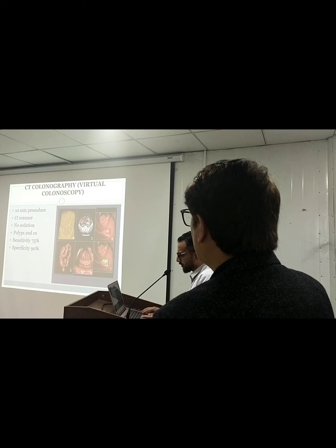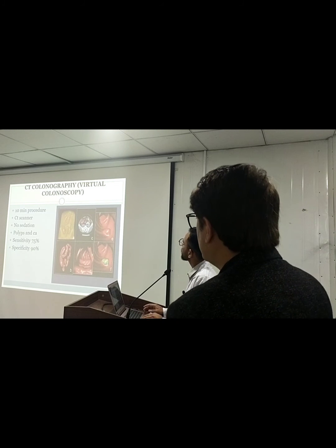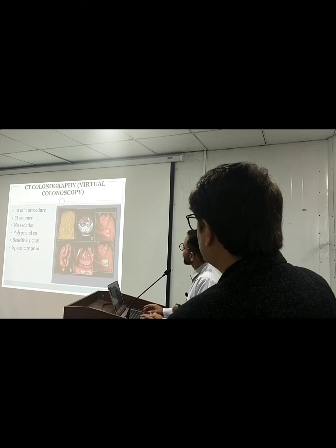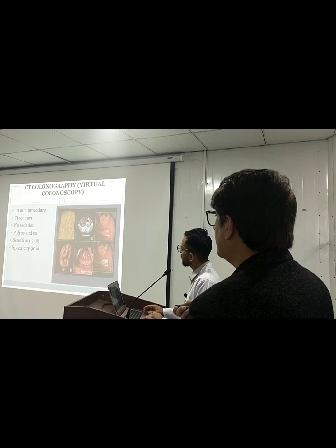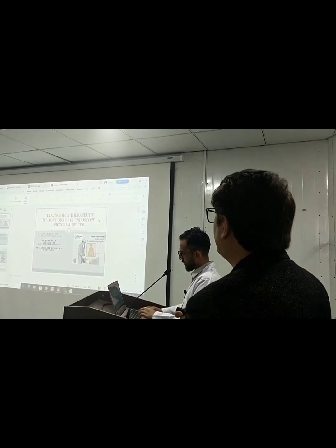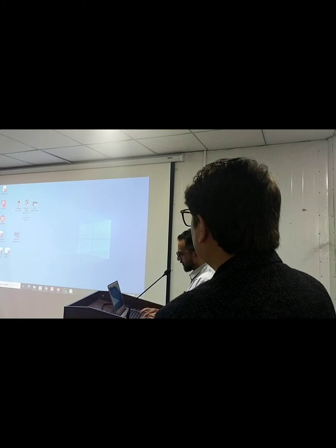CT colonography, virtual colonoscopy, and MR colonography are also virtual colonoscopy through which we can diagnose large lesions of the colon. It's a 10-minute procedure using a CT scan, and there is no sedation. Polyps and large cancers we can detect; sensitivity is 75% and specificity is almost 90%. So here we have some video clips of some procedures done.